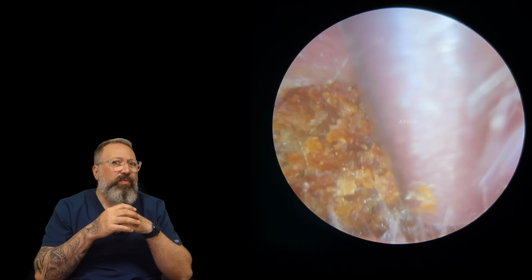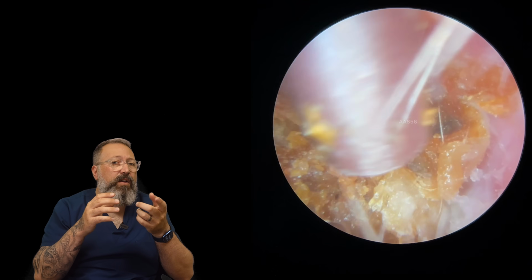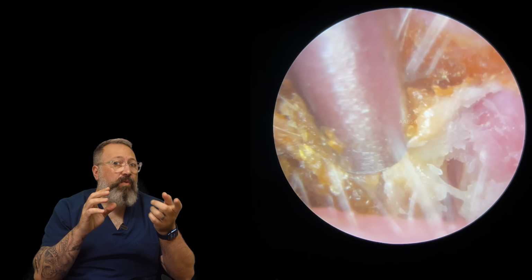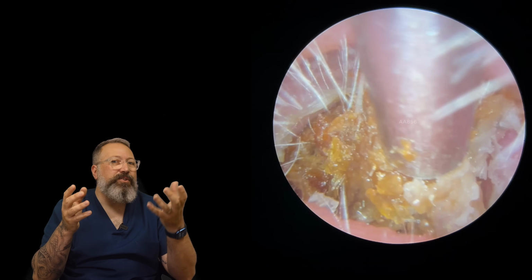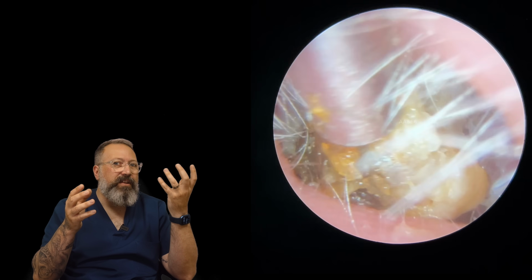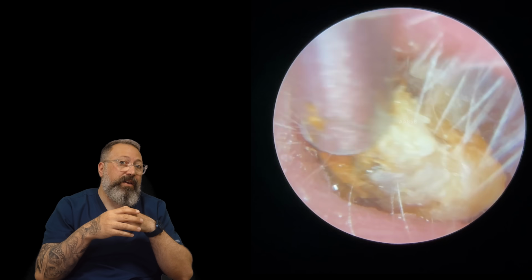There we go. Now I will warn patients sometimes, if you've got this wax and they haven't oiled it, sometimes we aren't able to get it out on the first visit. We have to get them to soften it and come back. But they don't mind so much because they can usually hear better from the other ear because we've cleared that one. Look at this coming away.